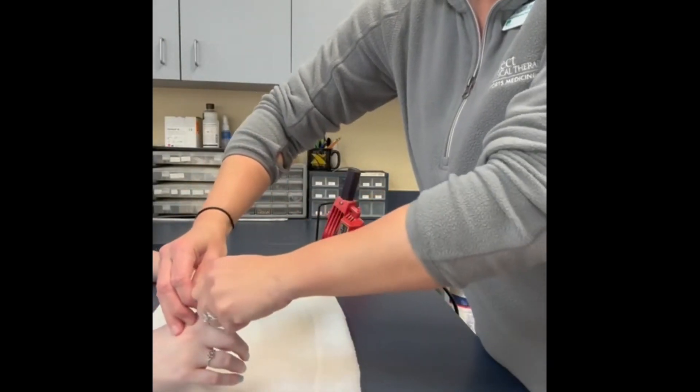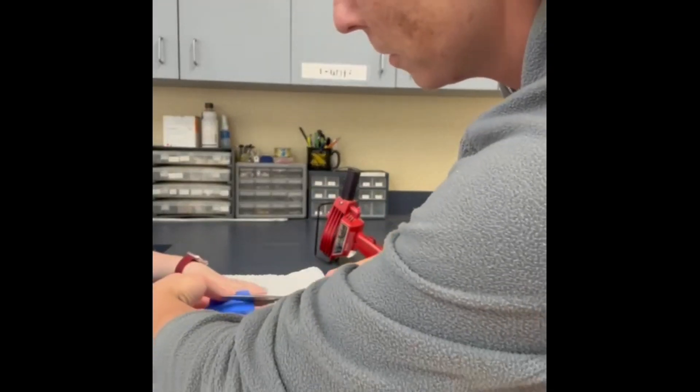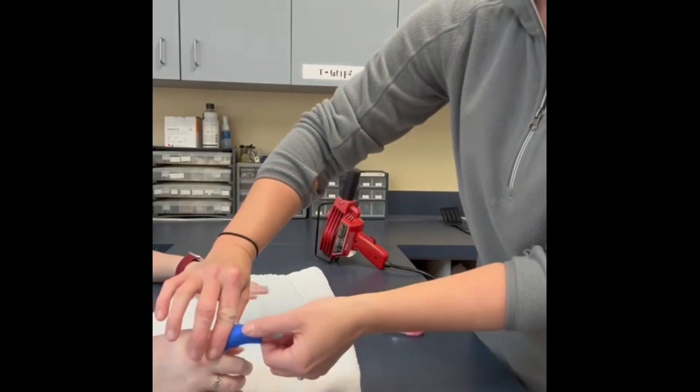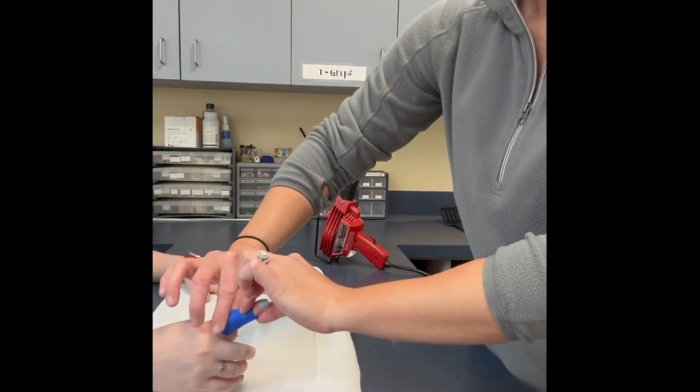Pull up and pinch the material dorsally along the entire finger to ensure proper fitting. Then cut any excess material along the dorsal finger, cutting away from the patient if possible. Smooth the material out along the dorsal finger before the material is completely dry and hard.